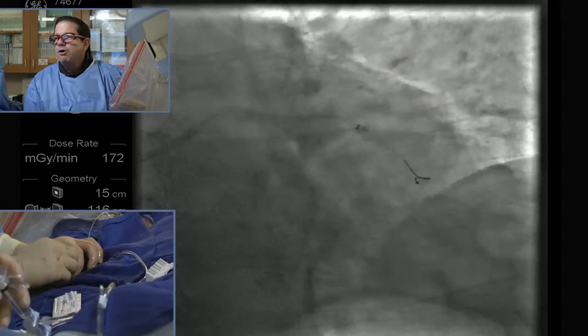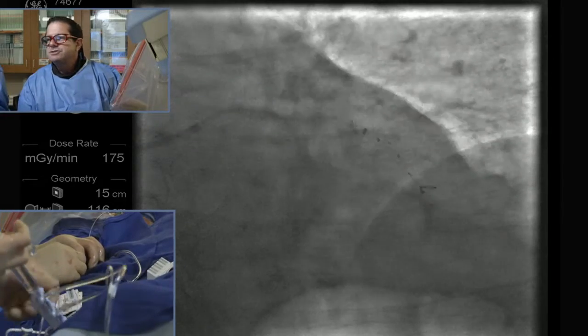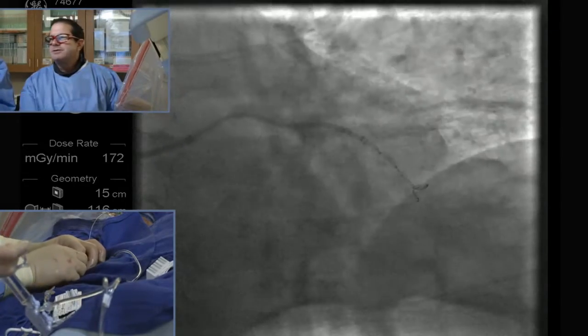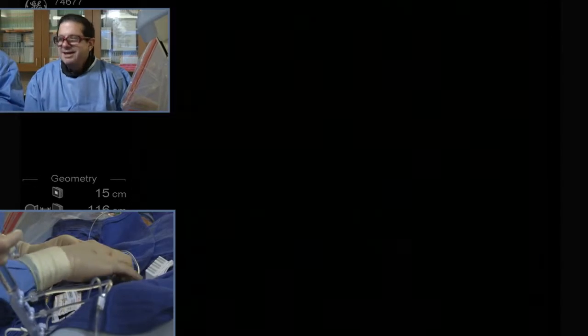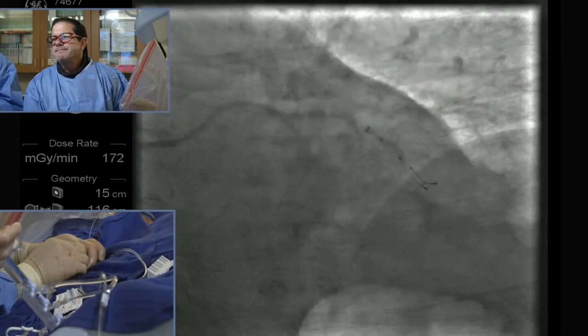I've taken the smaller NC balloon. Paul, how would you define complex PCI? Anything that takes me more than 10 minutes to do. I think it's very lesion-based, more lesion than clinical — bifurcation, left main, only remaining circulation, calcium. I want to see if I can get the guideliner to go even further.